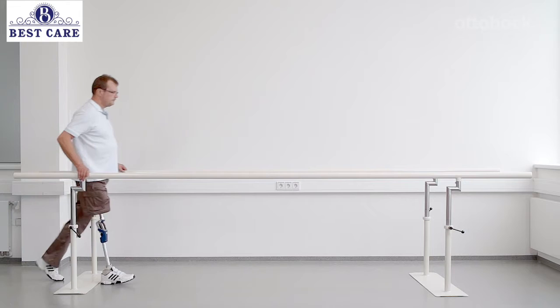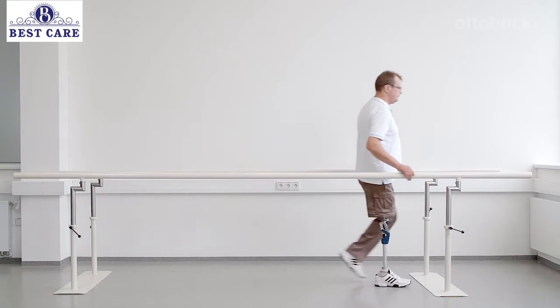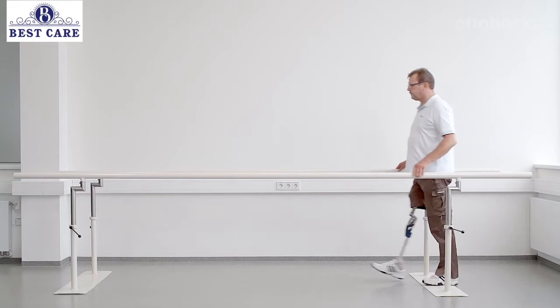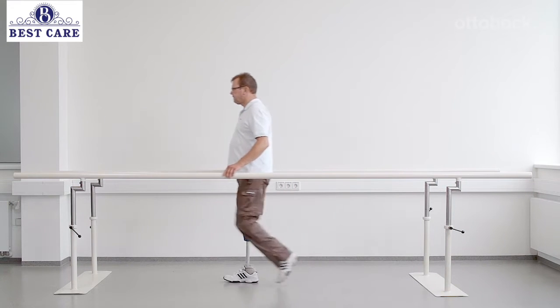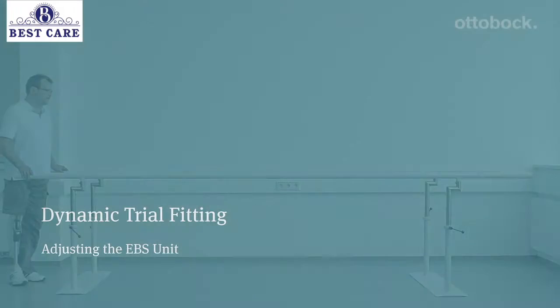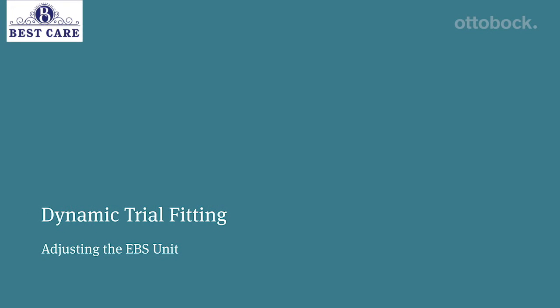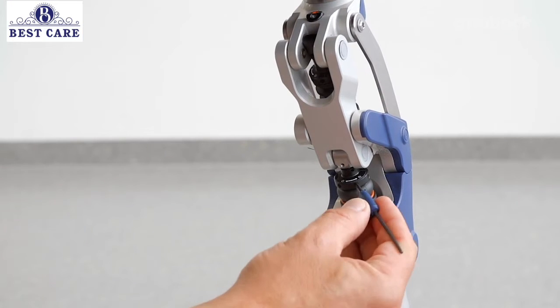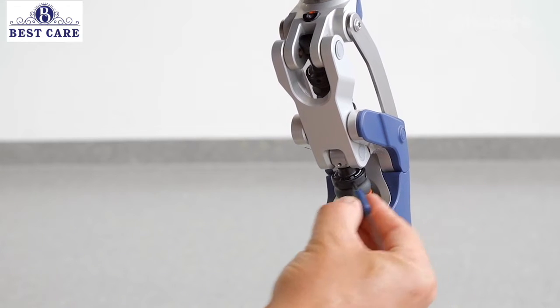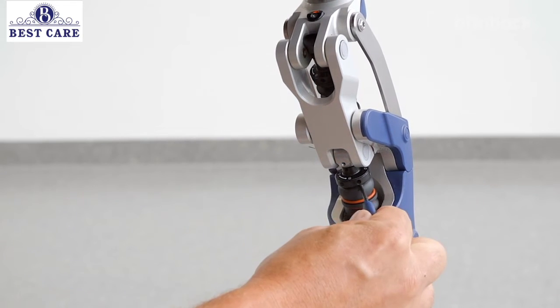To get a first impression of the swing phase control, let the user walk in the parallel bars with the factory settings. Knee flexion is controlled at heel strike by an adjustable elastomer element, and stance phase flexion is in the range of 0 to 10 degrees.